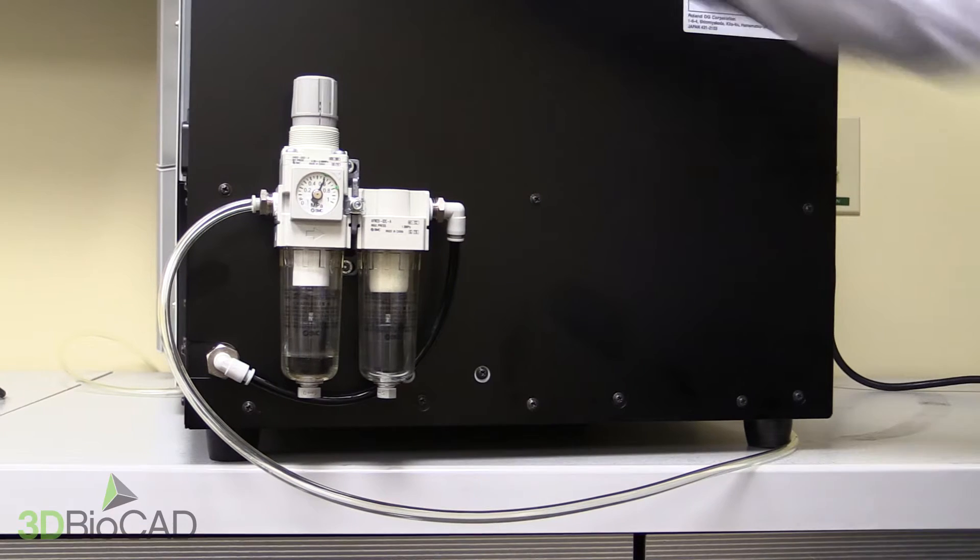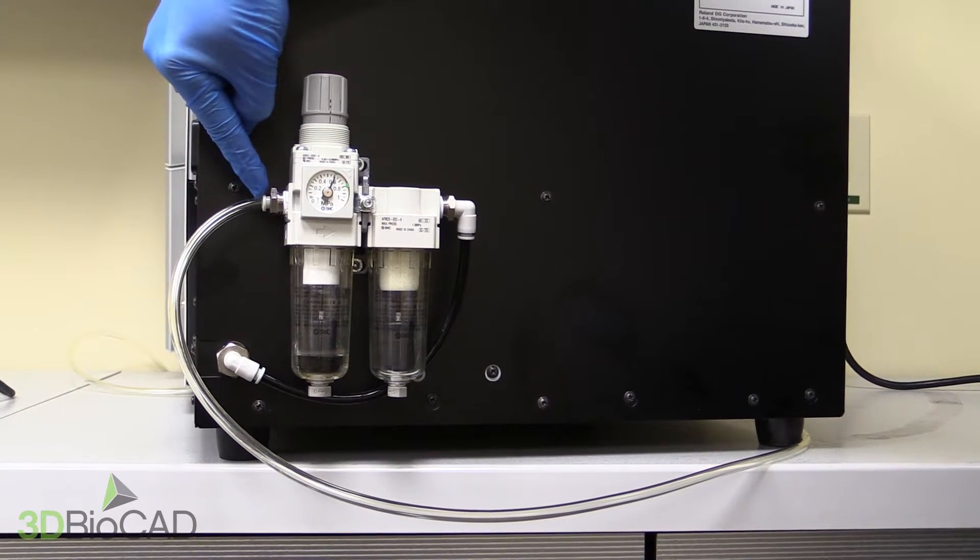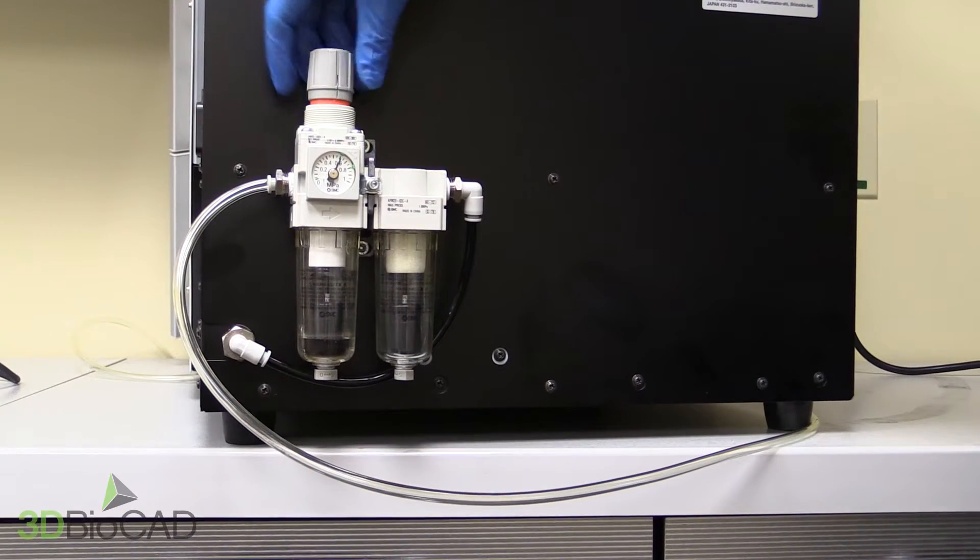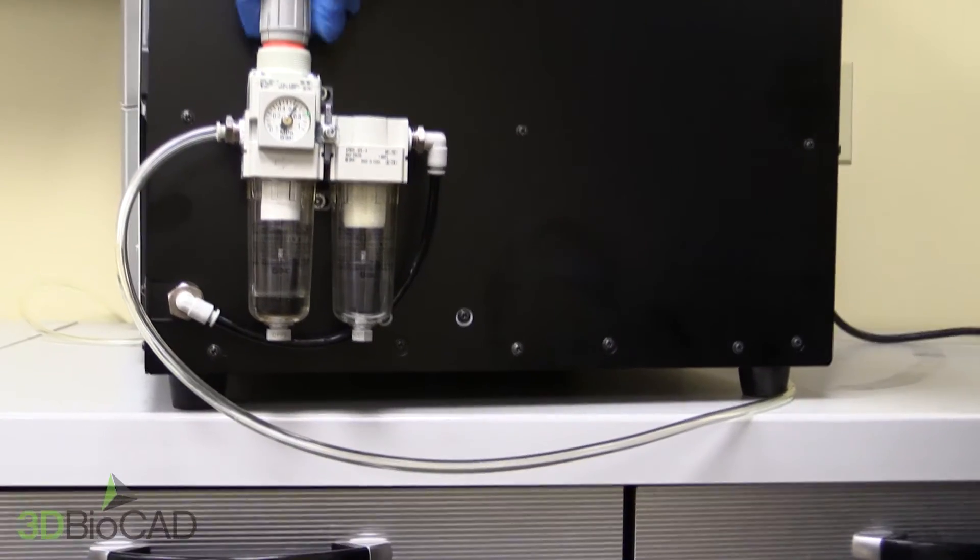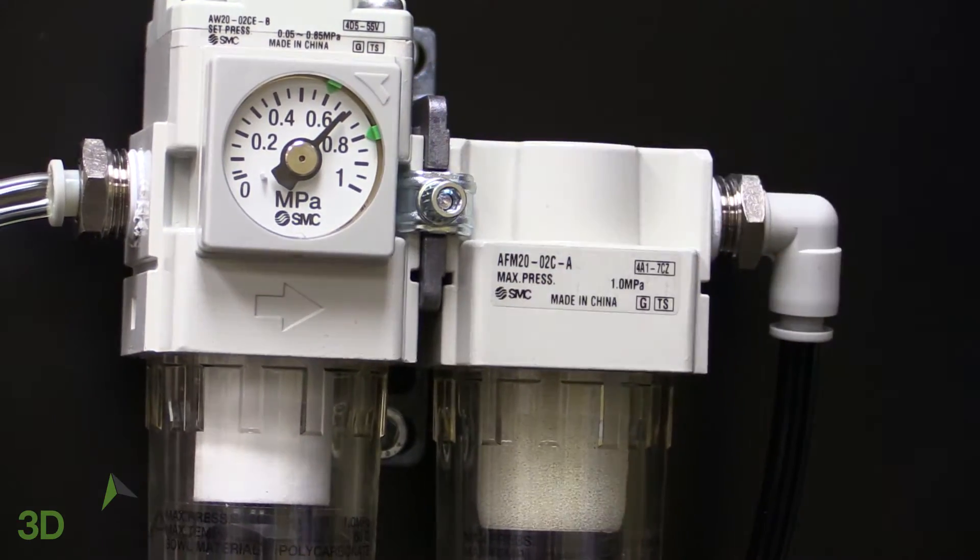The air hose connects to the left side of the air regulator. Pull up on the gray upper knob and turn clockwise until pressure is between 6 and 8.